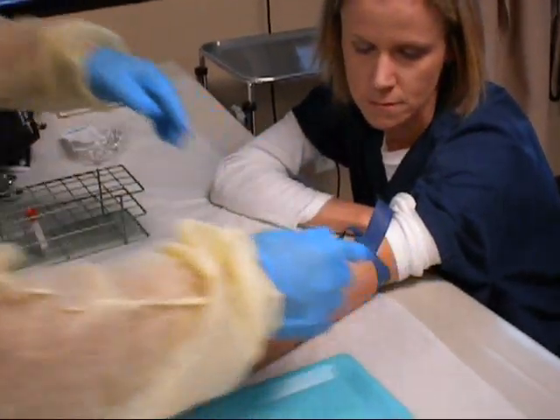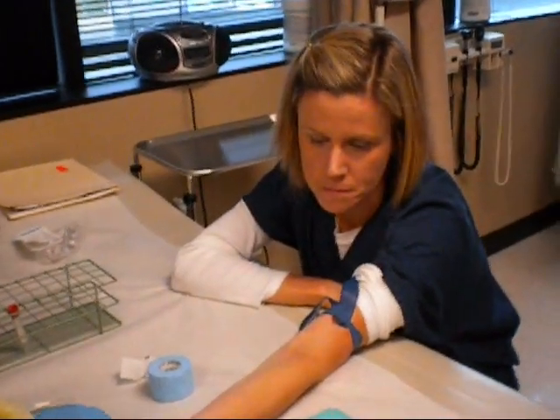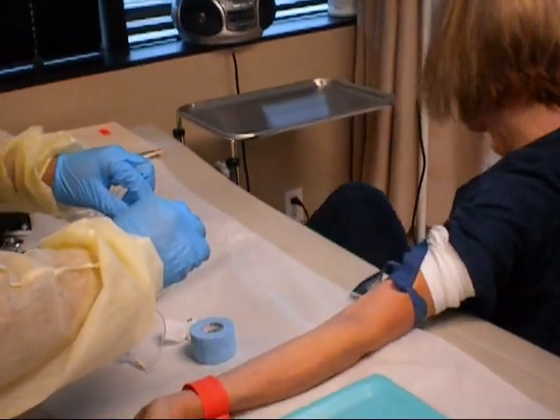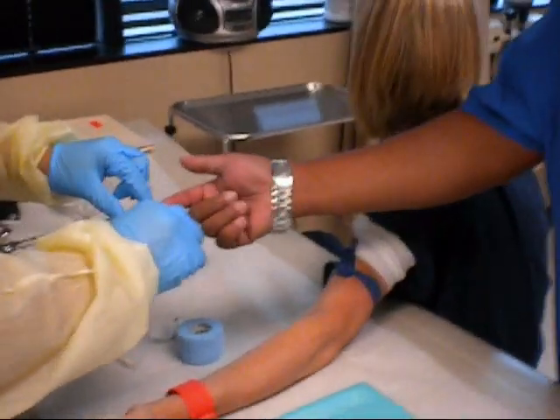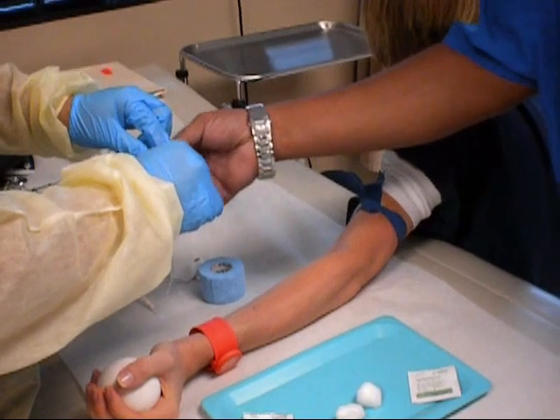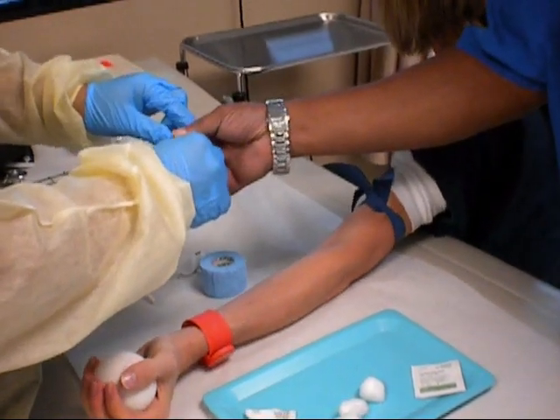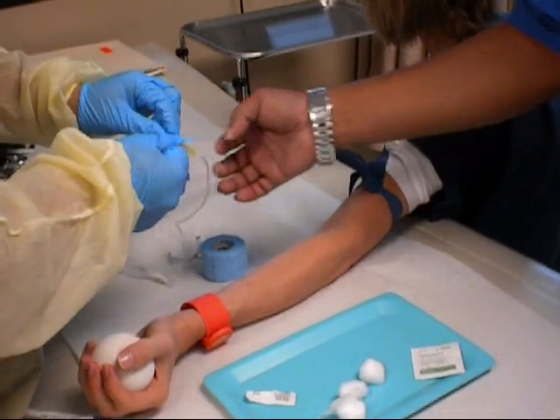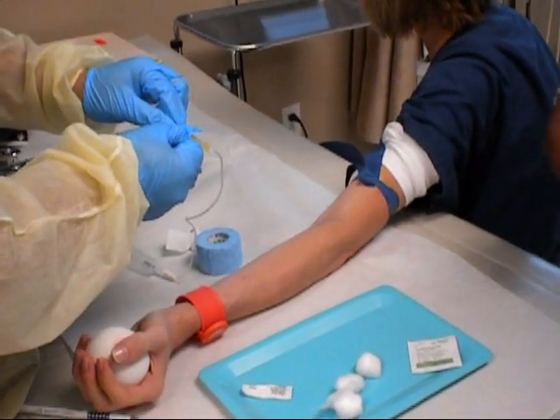You can see it. There you go. Now you can go ahead and put that up. We've got your back. This is your grip, so you want that to be down. You want it down. So you want to hold one of the wings. Go ahead and pull. There you go.